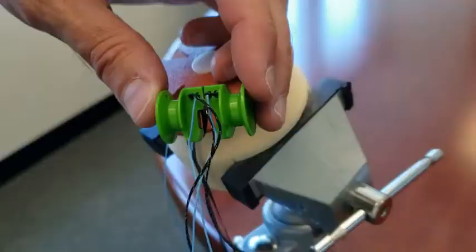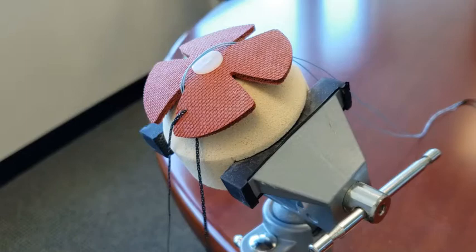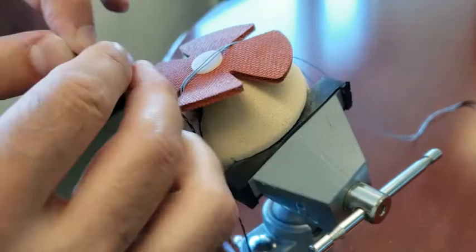The needles are housed inside the suture cartridge and you can start passing your needles at this point. Typically they're placed in a pattern that will optimize the compression footprint of the tendon. In this case we've already passed the first needle and now we're passing the second limb.